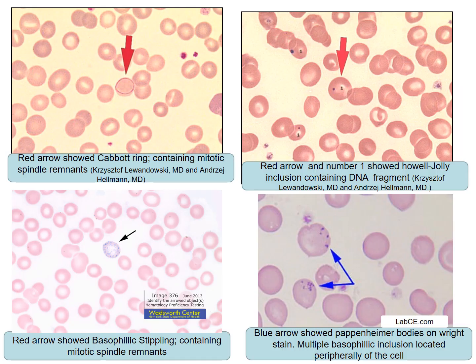In the first picture, the red arrow shows the Cabot ring, containing mitotic spindle remnants. In the second picture, the red arrow at number one shows a Howell-Jolly inclusion containing DNA fragments. In the third picture, the red arrow shows basophilic stippling containing ribosomal remnants. In the last picture, the blue arrow shows Pappenheimer bodies on routine stain — multiple basophilic inclusions located peripherally on the cell.